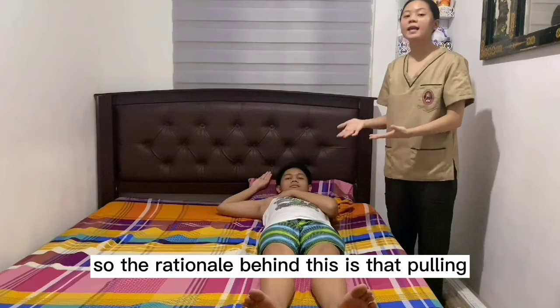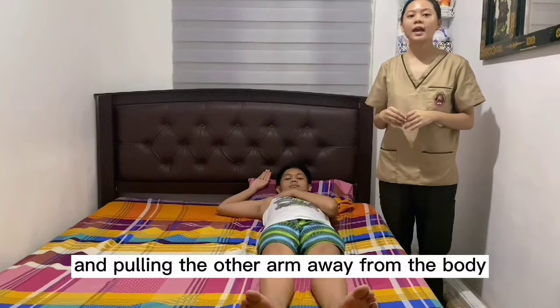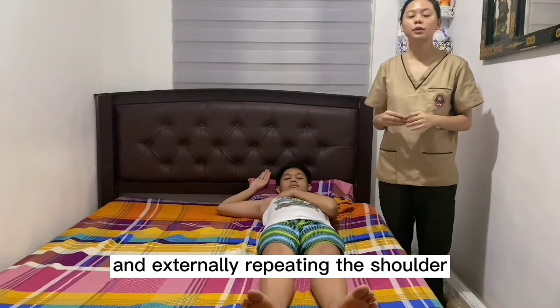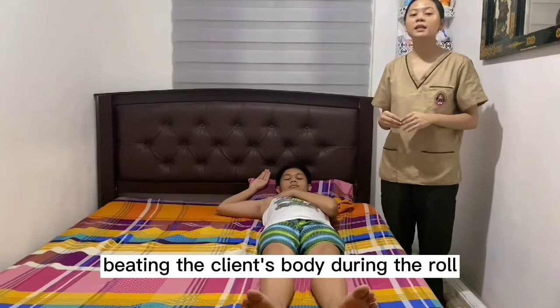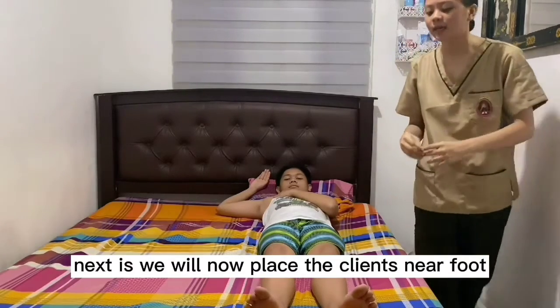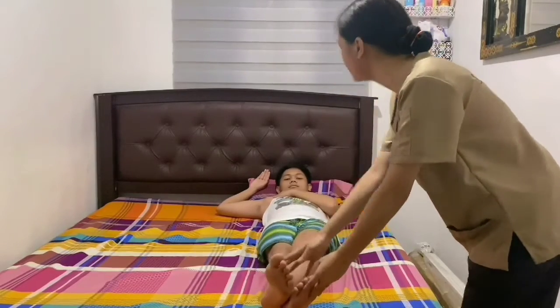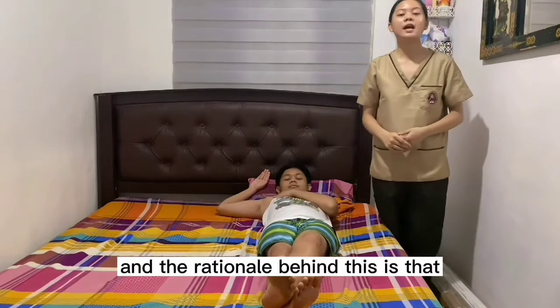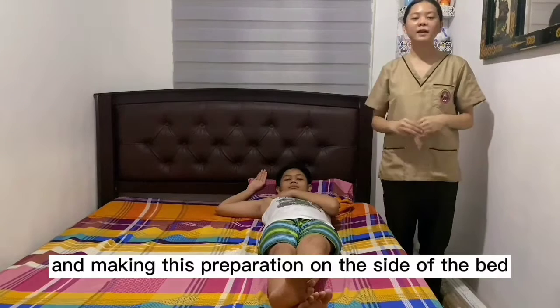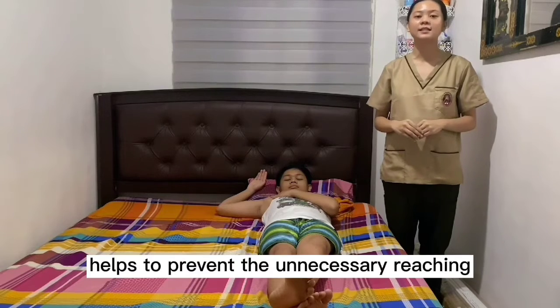The rationale behind this is that pulling one arm forward facilitates the turning motion, and pulling the other arm away from the body and externally rotating the shoulder prevents the arm from being caught beneath the client's body during the roll. Next, we will now place the client's near foot and ankle across the far foot and ankle. The rationale behind this is that this facilitates the turning motion, and making this preparation on the side of the bed closest to the client helps to prevent unnecessary reaching.